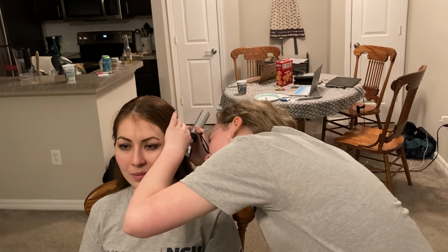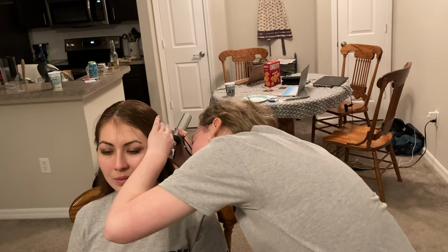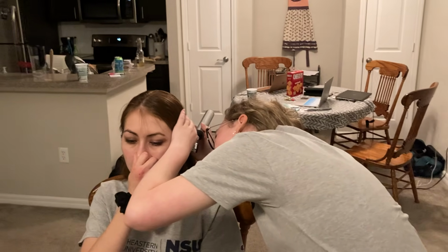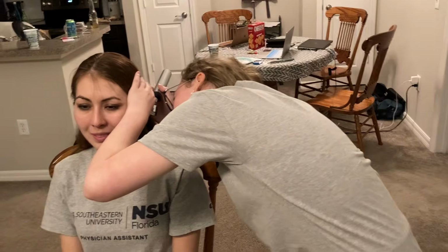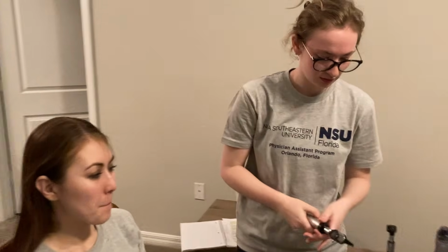Same thing as in the right ear. And I see again, middle ear has no fluid, and can you do the same thing? Plug your nose and pop your ears again. Perfect. See, the tympanic membrane is mobile again. Very beautiful. Okay.